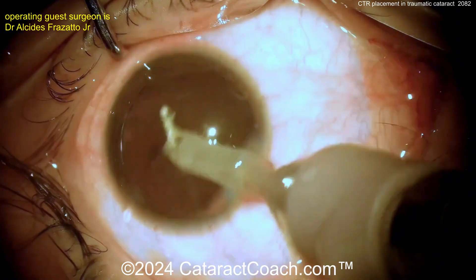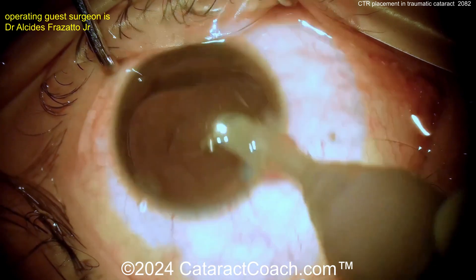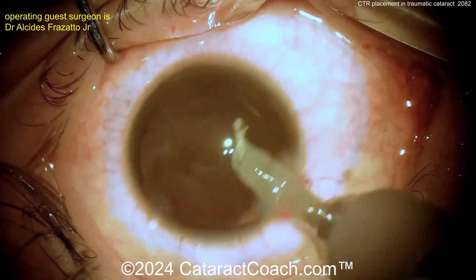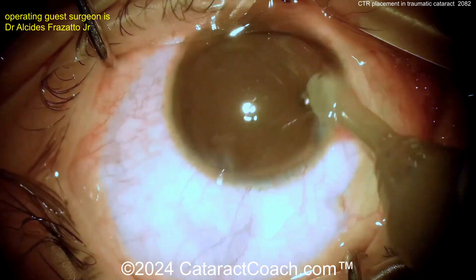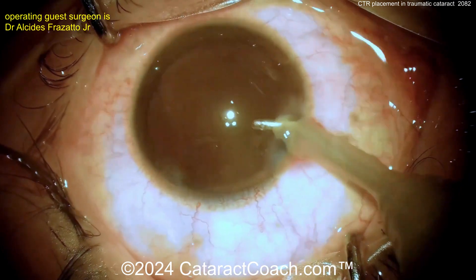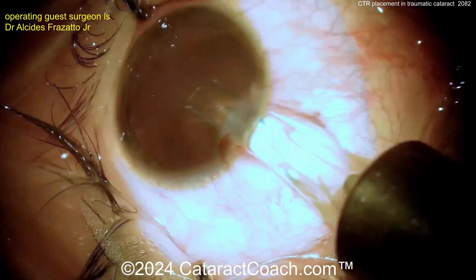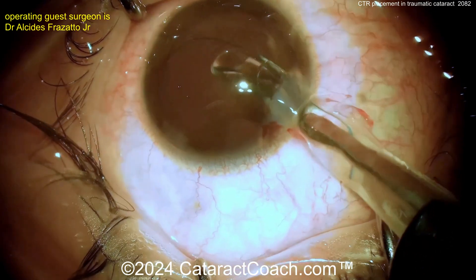Cleaning up the capsular bag here. I do a little bit less cleanup in a patient like this — you're almost certainly a young patient going to get PCO, and you're going to need to do a YAG laser at some point. So clean up as much as you can, but I wouldn't go overboard, especially in a case where you're suspecting some zonular laxity and there's a history of trauma. Now you can see that's done beautifully. You can still see the CTR edge there — so maybe there is some zonular laxity in that one area, maybe it is de-centering, because when you put the viscoelastic it looks better.